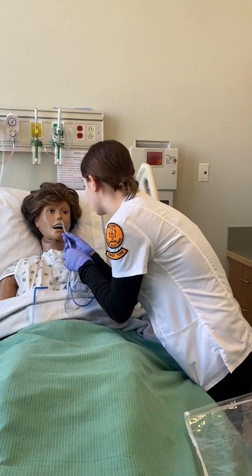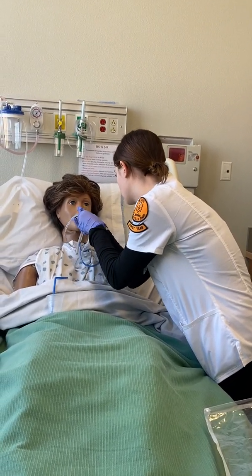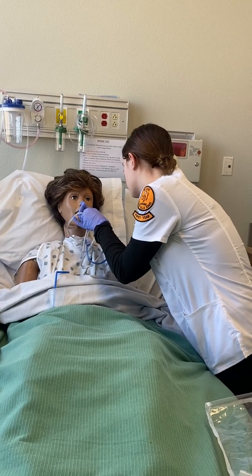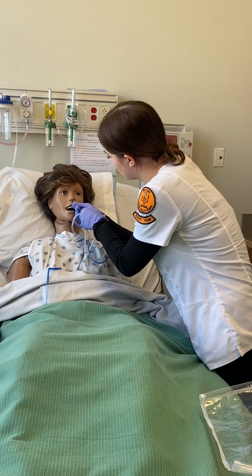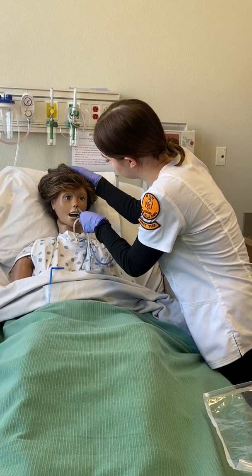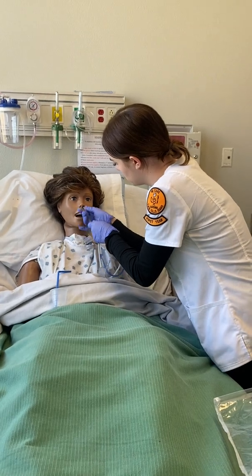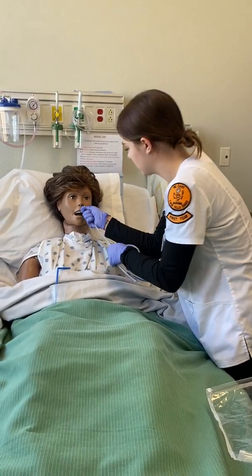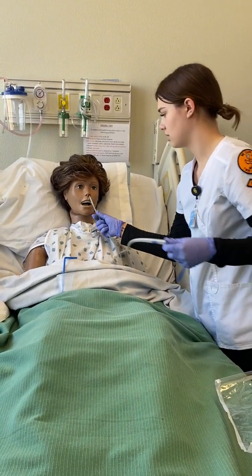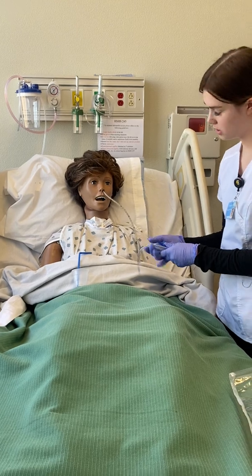Ready? And sip, sip, sip, sip, and I'm inserting it back towards your ear. All right, doing okay? Okay, go ahead and look down for me and sip, sip, sip. You're doing great. Perfect. All right. It's in, how you feeling? Doing okay?